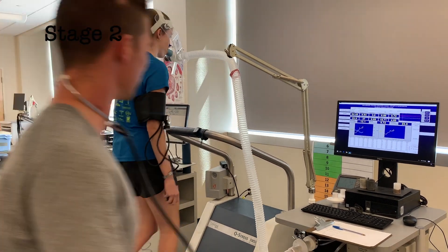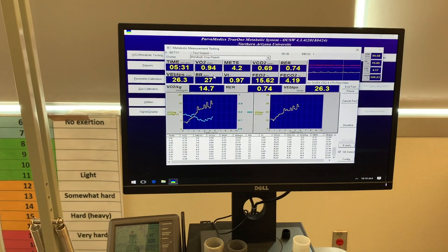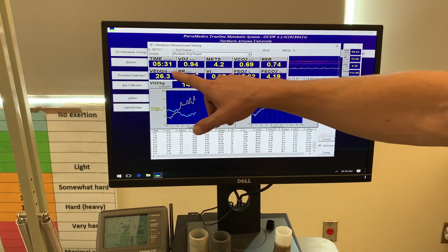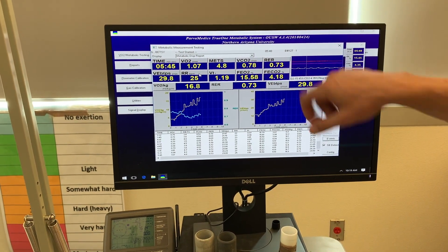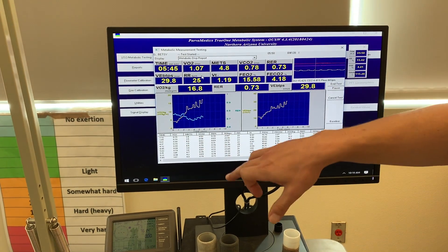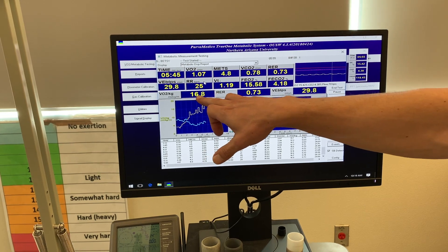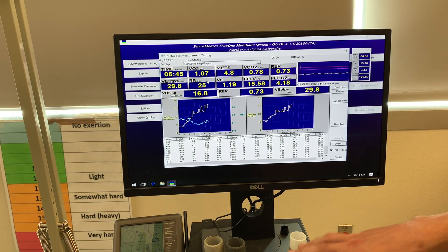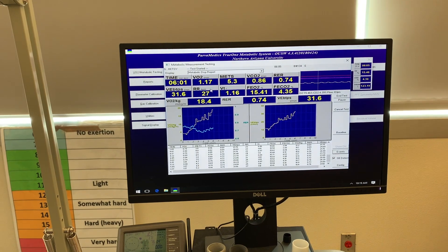Nice job Betsy, keep it up. What you can see on the screen here is the time where the sampling is taking place, VO2 in liters per minute, MET level, VCO2, RER, ventilation rate, and respiratory rate. Down here is VO2 in relative terms, so milliliters per kilogram per minute. We want to look at a combination of things to see when the individual is getting close to their max.